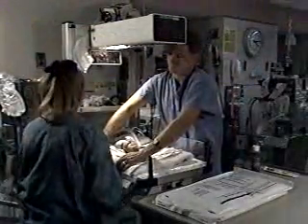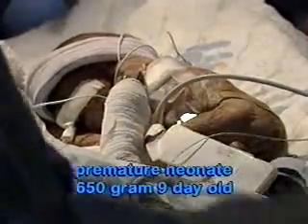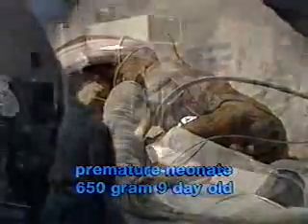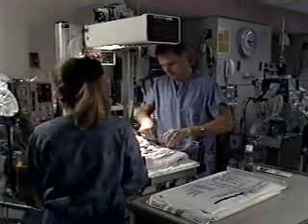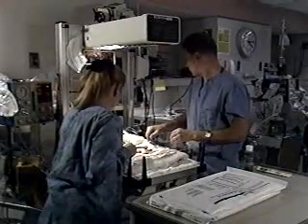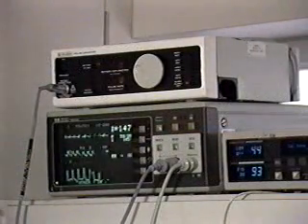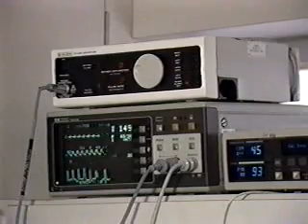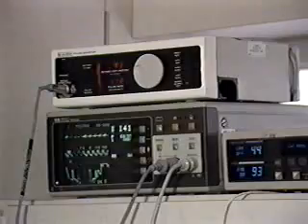We will now demonstrate the LP procedure on a premature neonate. This neonate is a 650-gram, 9-day-old who required a lumbar puncture to rule out meningitis. This neonate is intubated and on a respirator on low support. In performing the procedure, it is critical that the practitioner assess the neonate's ability to tolerate the procedure, particularly the respiratory and cardiovascular systems. The neonate is monitored with heart rate, respiratory rate, central blood pressure, and oxygen saturation monitors.